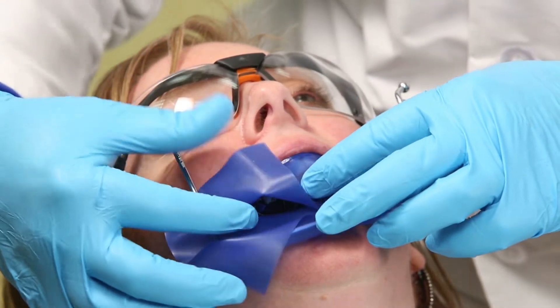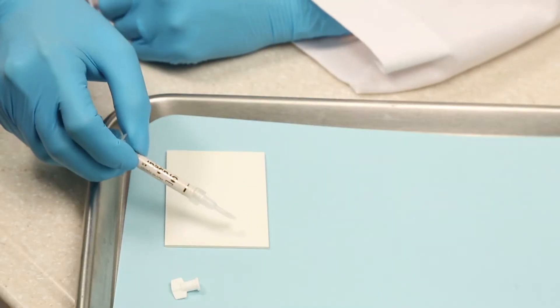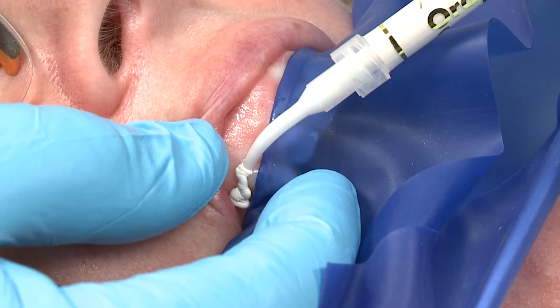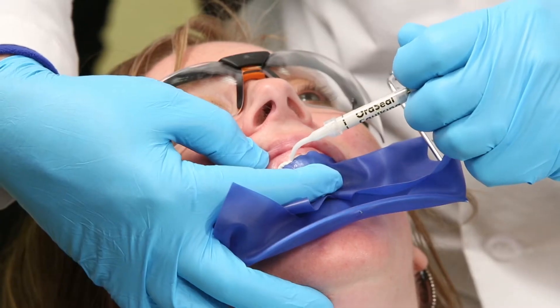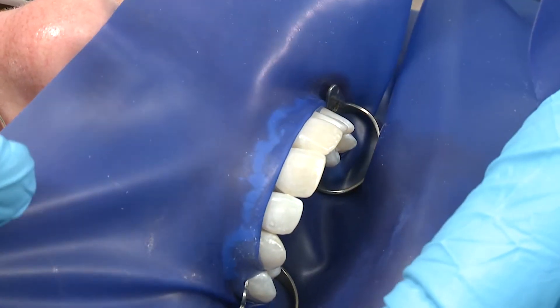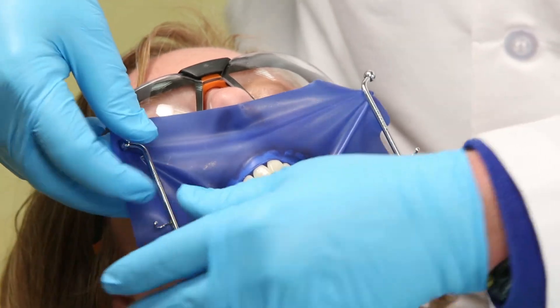Simply peel back the rubber dam to expose the tissue. Express a small amount on a pad first to check flow, then express a thin ribbon of OraSeal caulking beneath the rubber dam along the gingival margin to prevent leakage. Reattach the rubber dam to the frame and reinvert the rubber dam where needed.